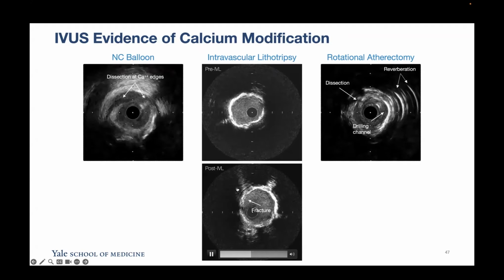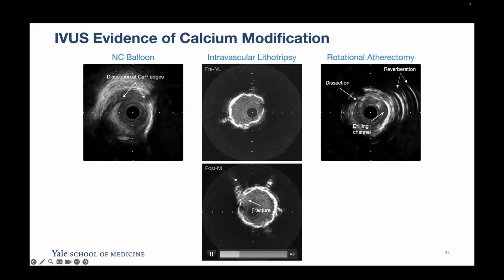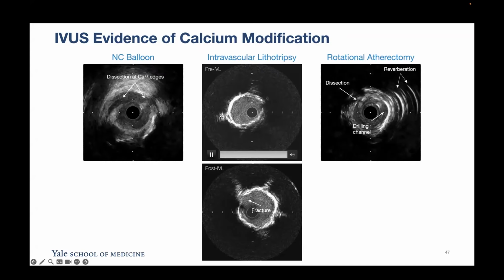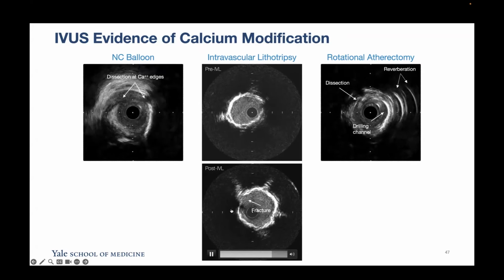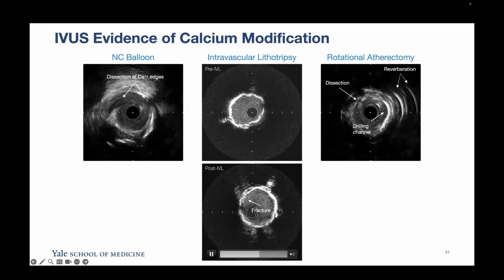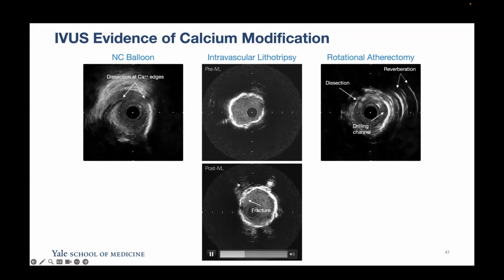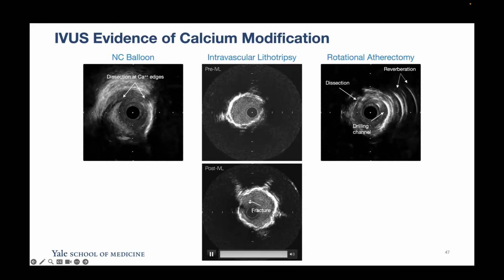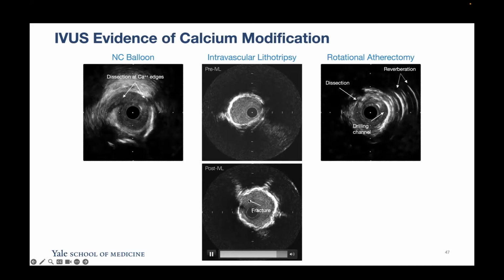And more important, if you look at the deep structure, you see now that the ultrasound signal can pass through, as opposed to here, where you have everything blacked out. So not only the fracture, and it's better to see movement, but also the presence of signal behind sometimes is a little trick that we can use to find these small fractures.